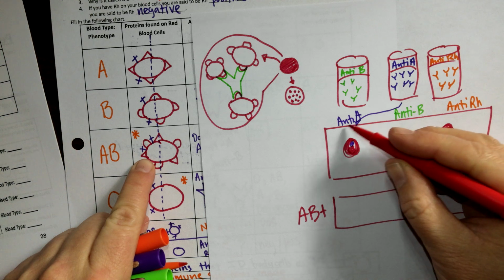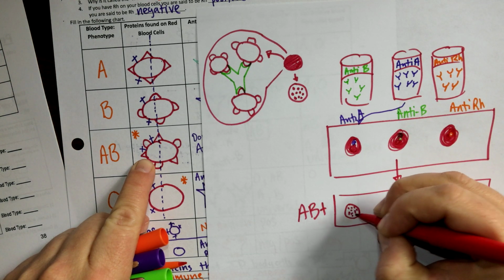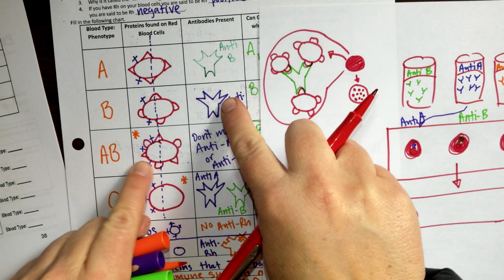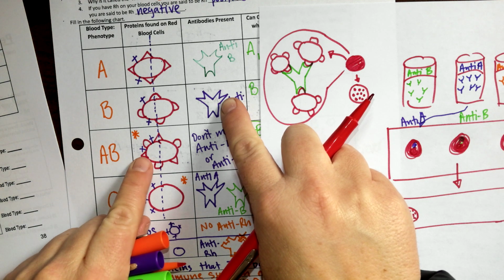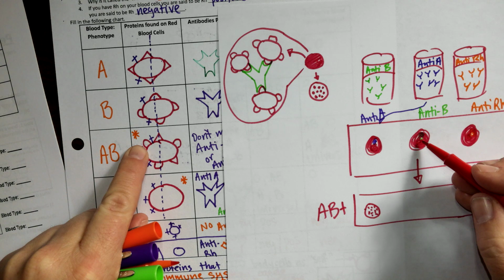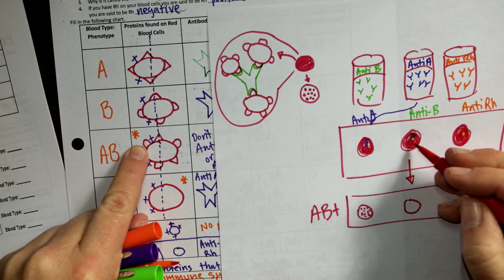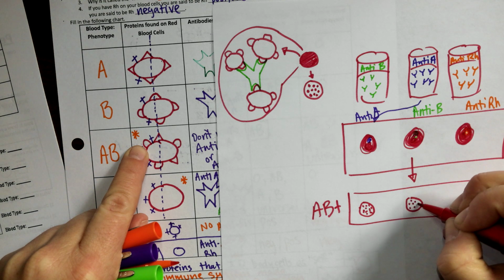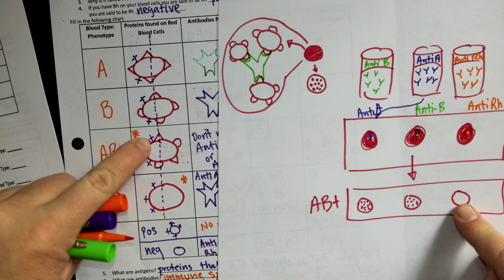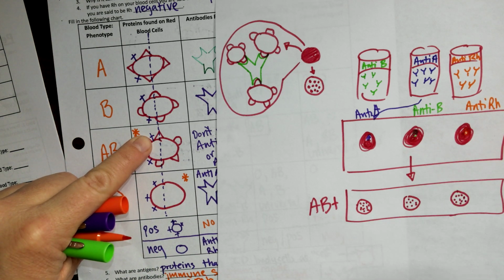So when the blood mixes with anti-A, then that droplet of blood will start to look clumpy. It'll start to form clumps, because anti-A, this shape, is grabbing onto this. It found that shape to grab onto. If you have the bumps, then anti-B will grab onto it, just like this. So instead of looking smooth like these look still, it would start to look clumpy. And if you have RH, then it'll grab onto the RH and it'll form clumps.